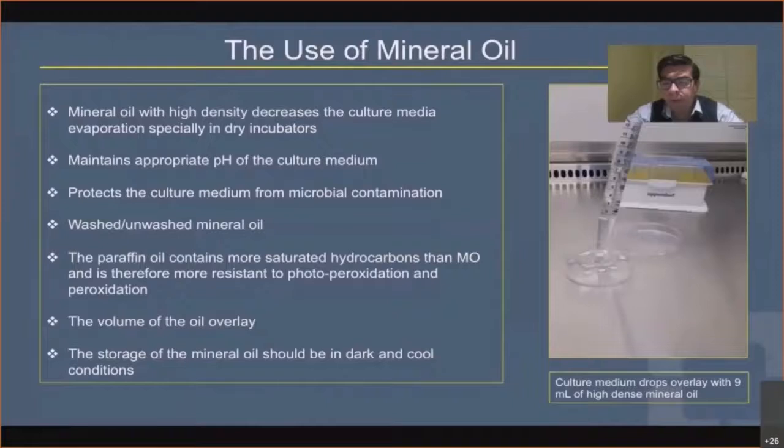On the other hand, according to our IVF protocols, we don't wash the mineral oil with culture media anymore, which was done to try to minimize the adverse effects of the mineral oil on the embryo culture media during the in vitro culture period, because with the current production of high quality mineral oils by the companies, this is no longer needed. Neither do I recommend testing the culture media and the mineral oil in our IVF laboratories by means of the human sperm survival motility assay, or the mouse embryo assay test, because manufacturing companies do it.